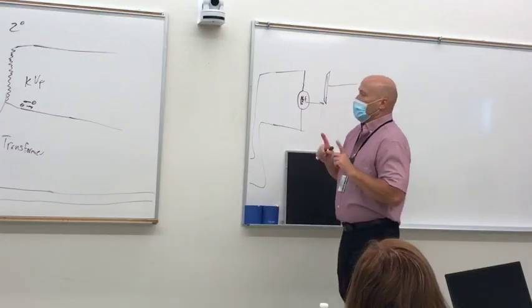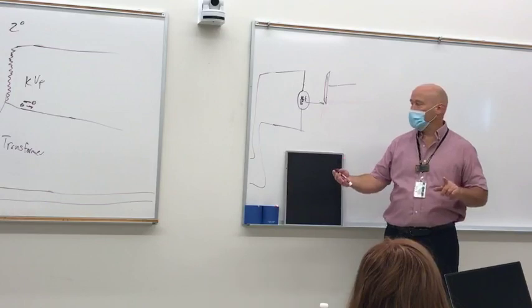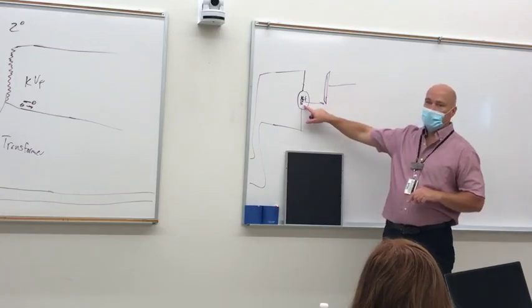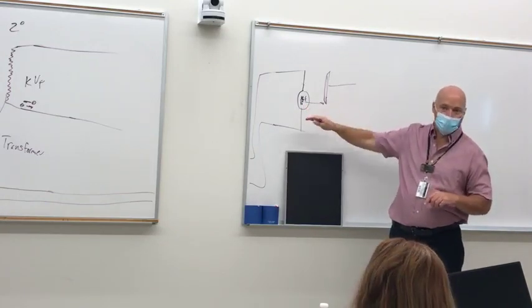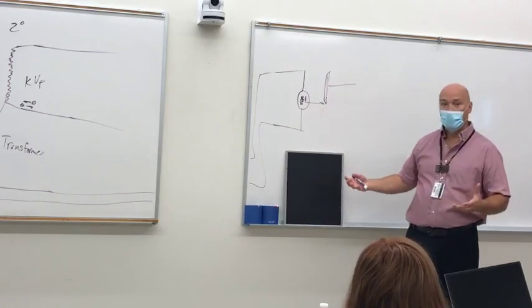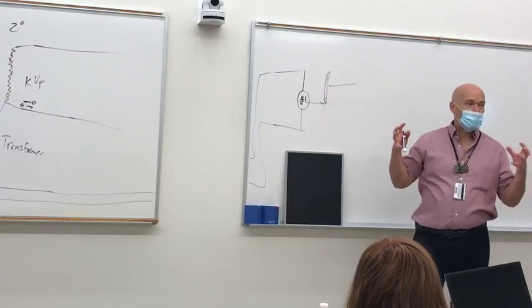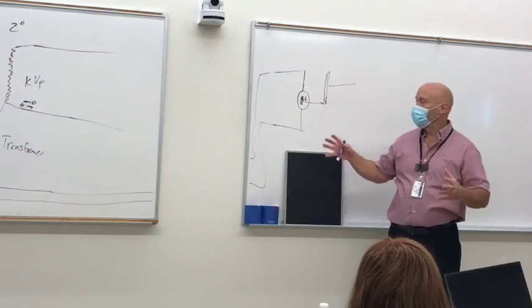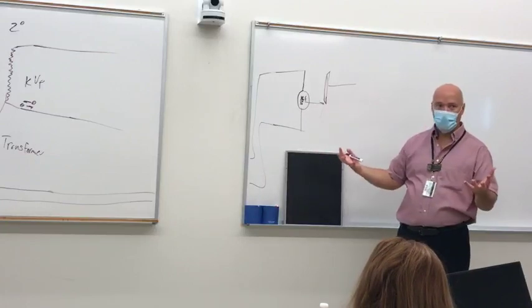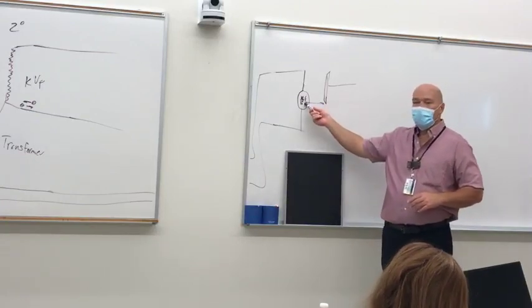All right, so when we push that prep button, this heats up just like a light bulb. No different from a light bulb. It just heats up to the point of glowing. If it wasn't inside that big tube of housing, you could actually see it glow. You can't see it glow, but if all that was taken away, you could see it glow just like a light bulb. So that heats up, okay?